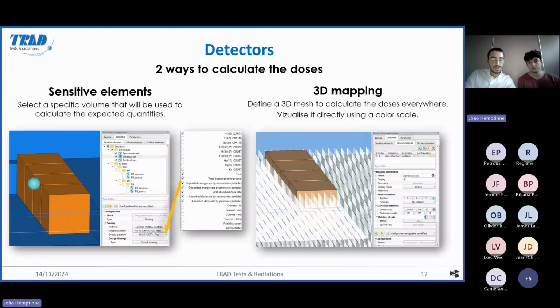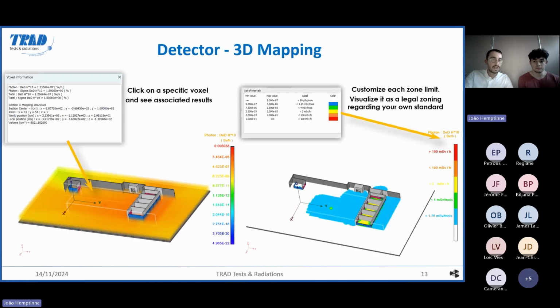Quick switch on my slides. As Leo just said, when you have set up your mapping, your mesh, you are ready to launch the calculation. The final result of the calculation, in our case, is a 3D mapping with a color map. You saw an example of this one at the start with the color scale, etc. And you have different ways to visualize it. You can do something continuous. You can do it by voxels, and you have the detail for each voxel.